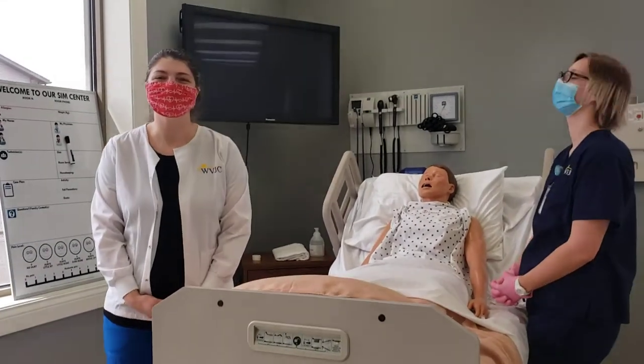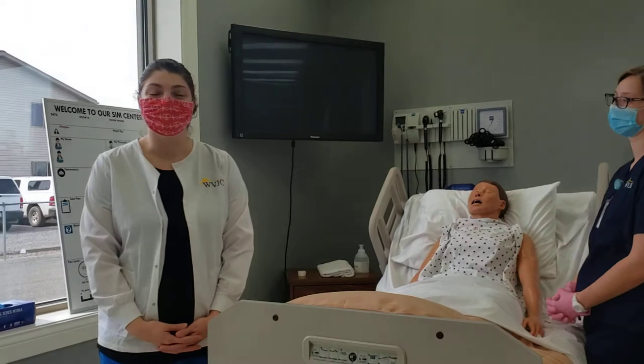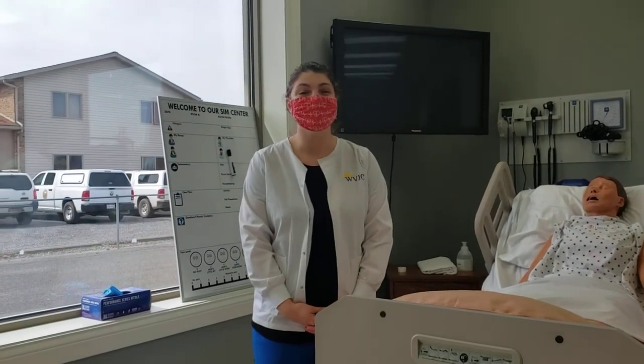Hi, my name is Amanda. I'm a clinical instructor at West Virginia Junior College, the Bridgeport campus. Today we're going to demonstrate how to give an intramuscular injection.